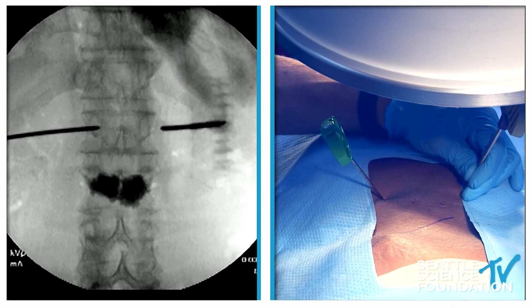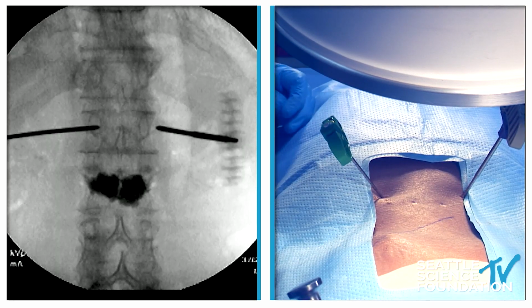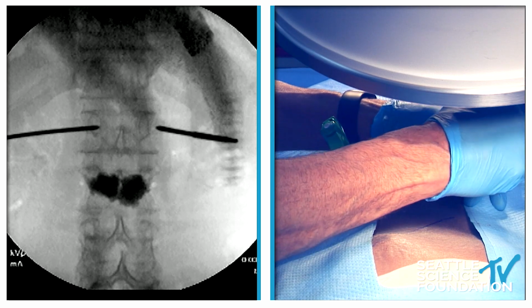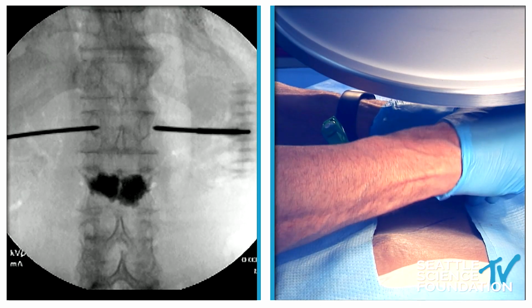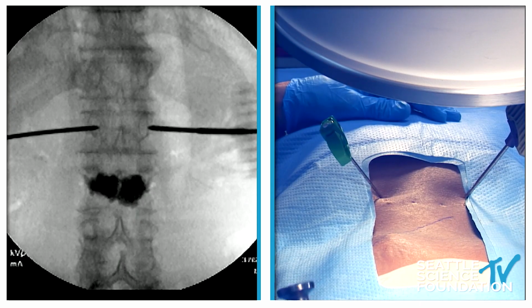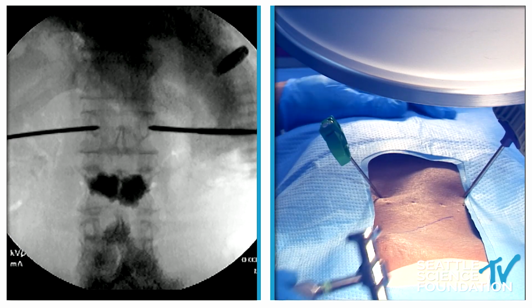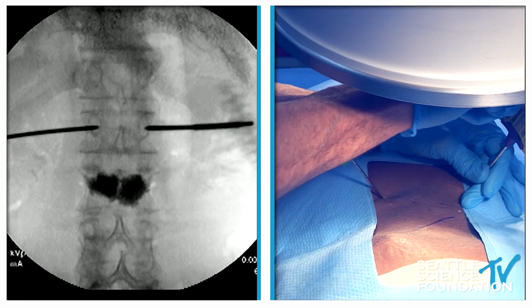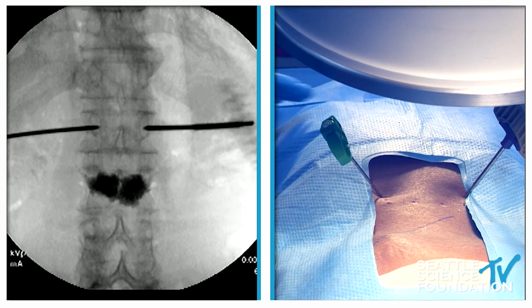Exactly, and the mechanical aspect for the spine jack is fairly profound. The ability to generate force with this is what really separates this from other devices. This demonstrates a lifting force between 500 and 1,000 newtons. So if I put it under your heel, it would lift you off the ground. So this is a fairly profound lifting force.